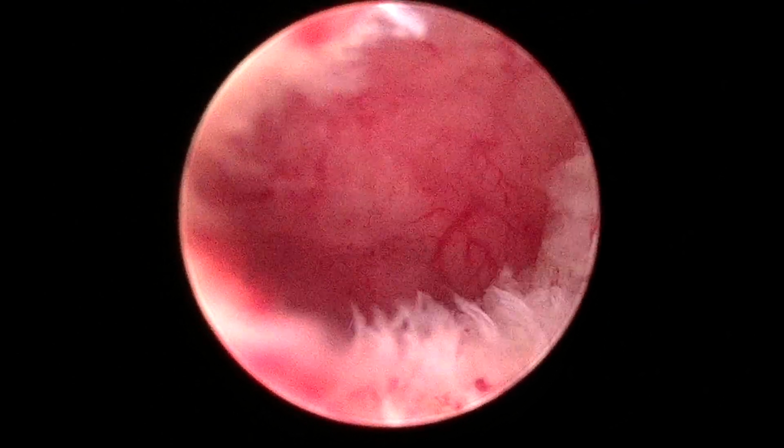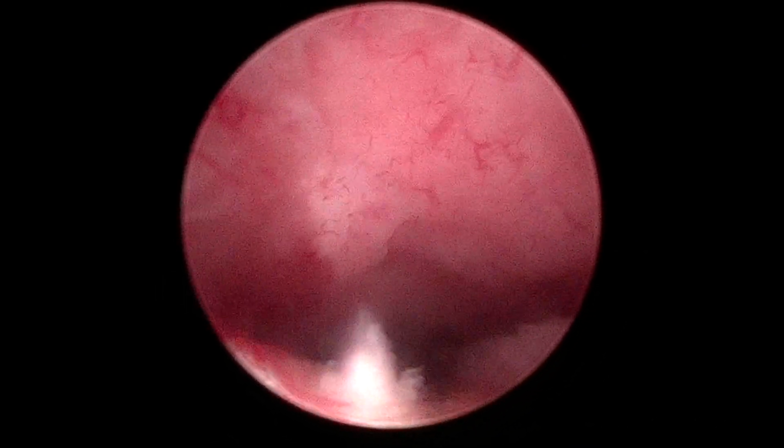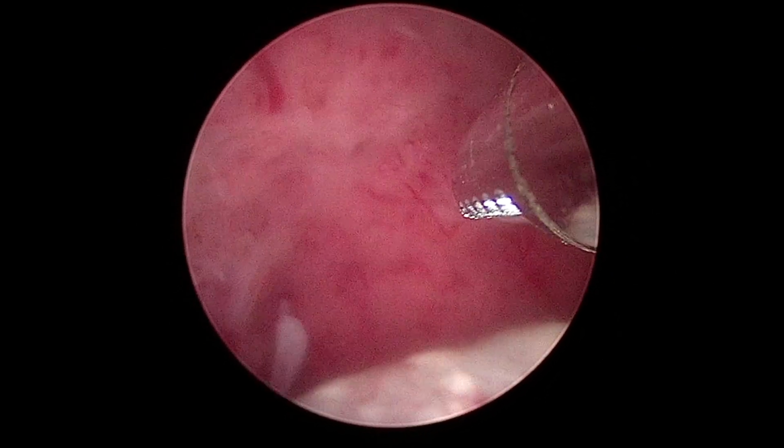Now we move with the bevel of the scope towards the internal os, and you will now appreciate that the uterus is retroverted. So what we are seeing is a retroverted uterus. Here we have to lift our external hand of the scope so as to enter the cavity. Gradually and steadily, without any pain to the patient, we enter the cavity. We suck out all the collected blood inside the cavity.